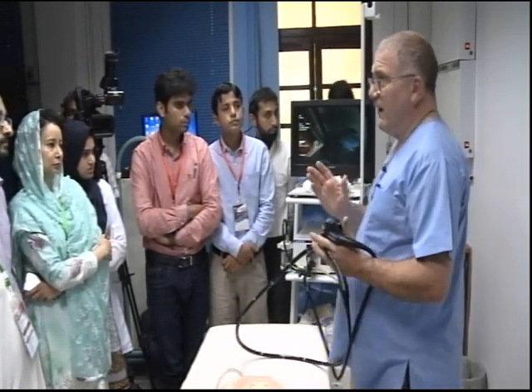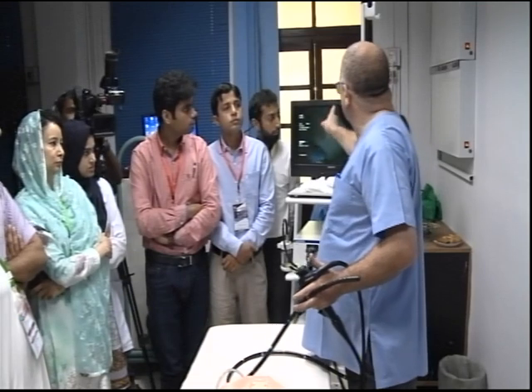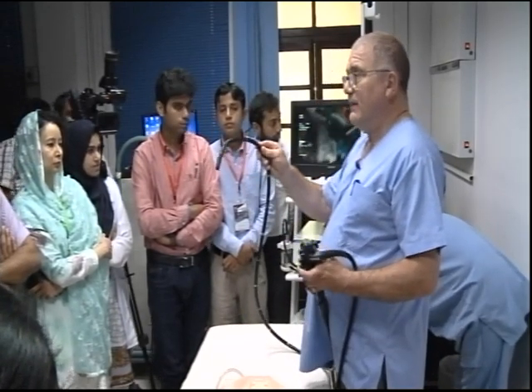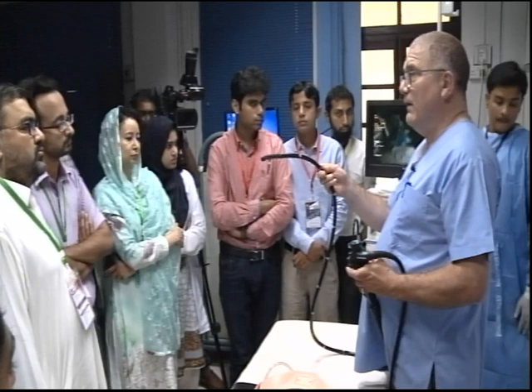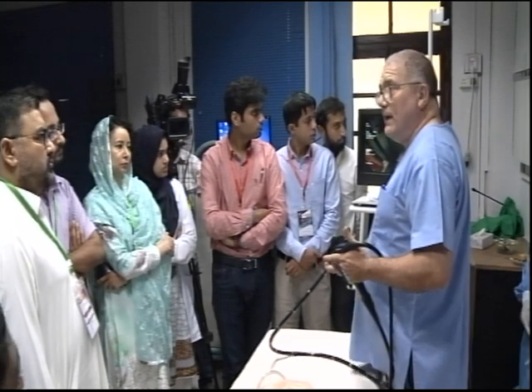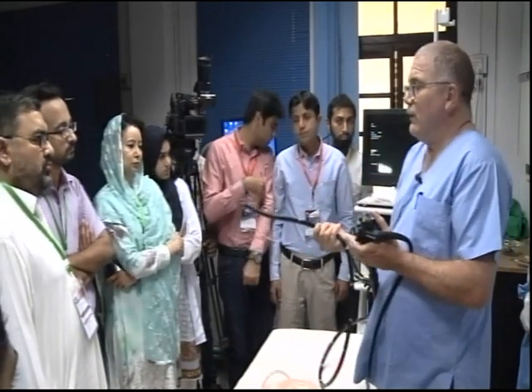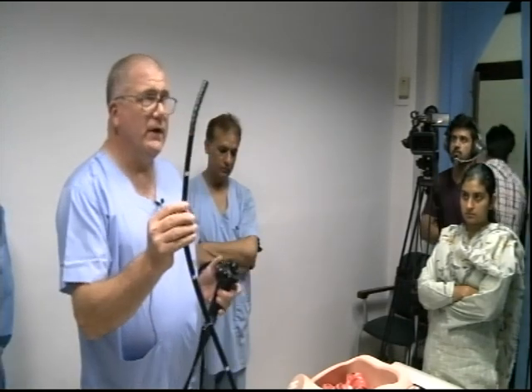So what I wanted to show you is that on the screen, we always like to have the maximum where we're actually looking where the lumen is. We're always wanting it at 12 o'clock. So regardless of the orientation of the scope, outside the patient will see it looking down. Outside the patient will see it looking to the left. But on the screen is what we're reacting to. We can't see that. But all we know is that it's going in that direction. As long as you have an idea what it's doing, it doesn't matter if it's looking here or there, it's always going to go up and down, right? The reason why we want it to go up and down is this.